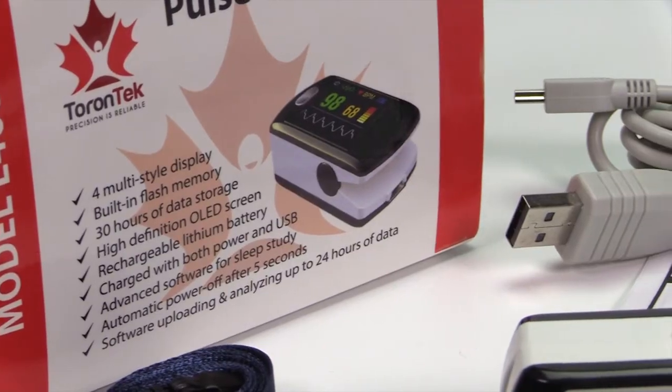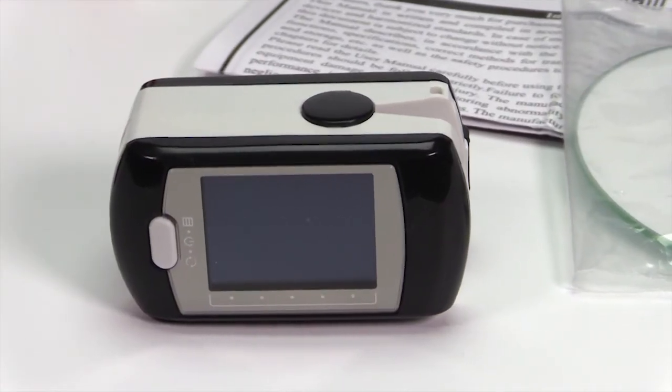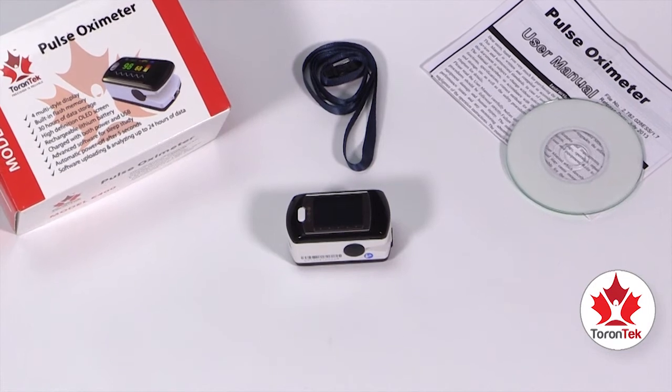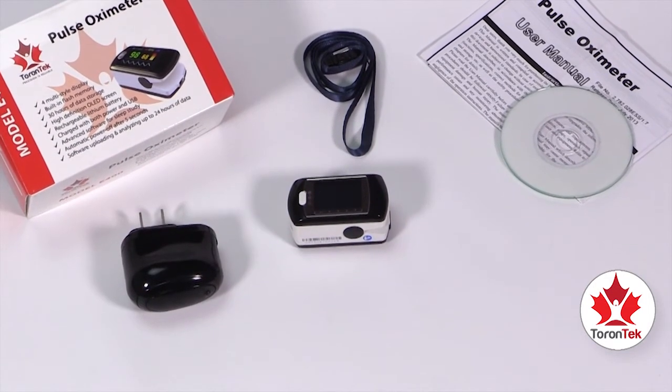The Torrentech E400 has a built-in lithium battery, making it the perfect device for continuous monitoring of your oxygen blood levels over time. Charging the battery is very simple. You can charge it with the wall charger provided with the device or through a USB port.